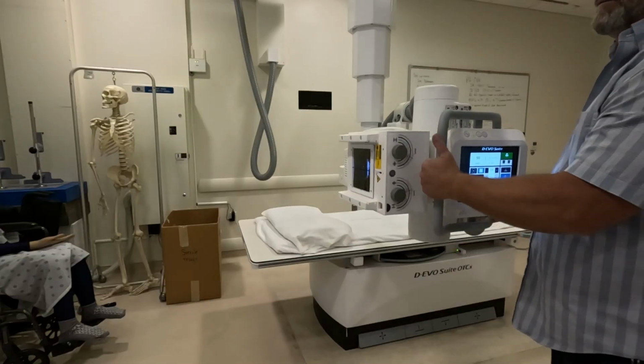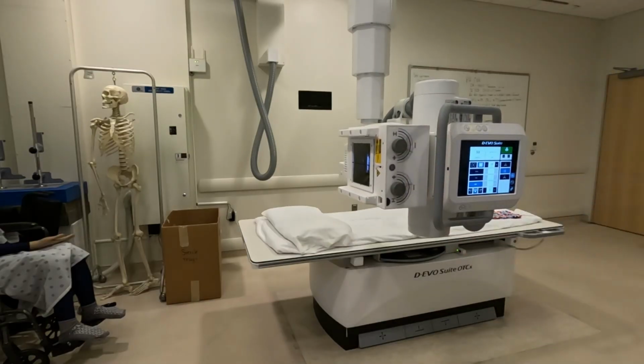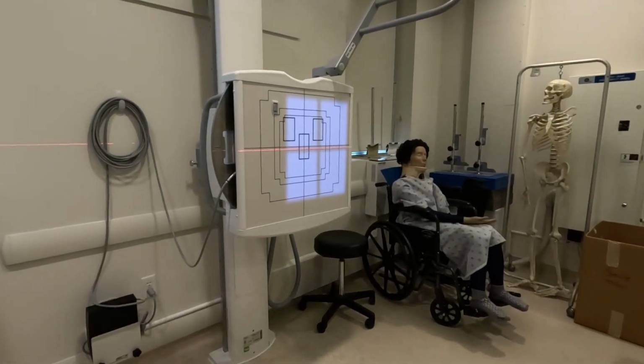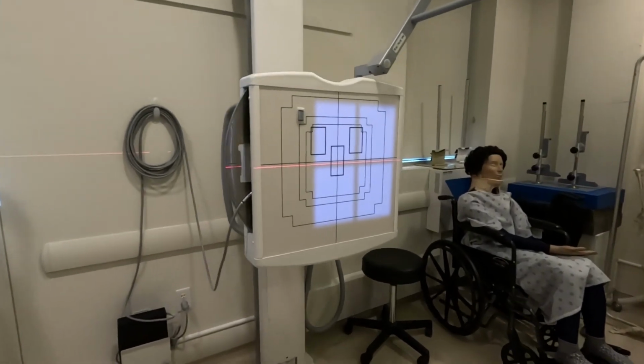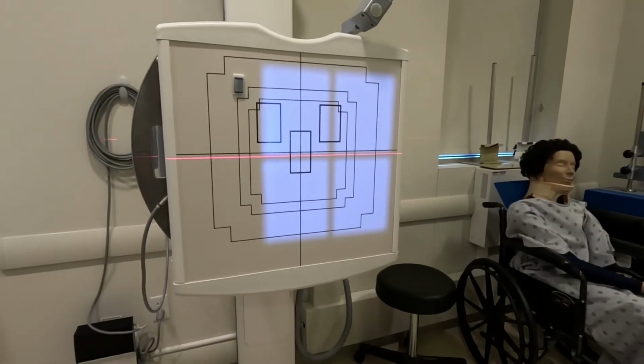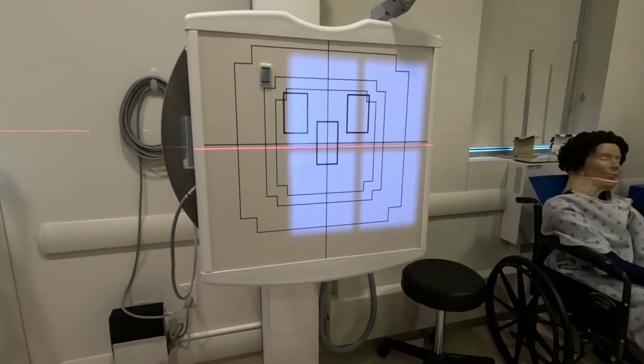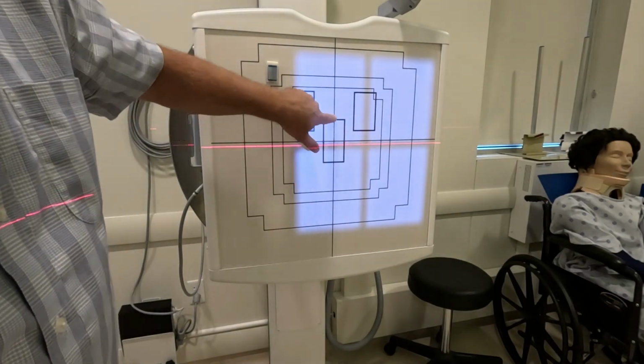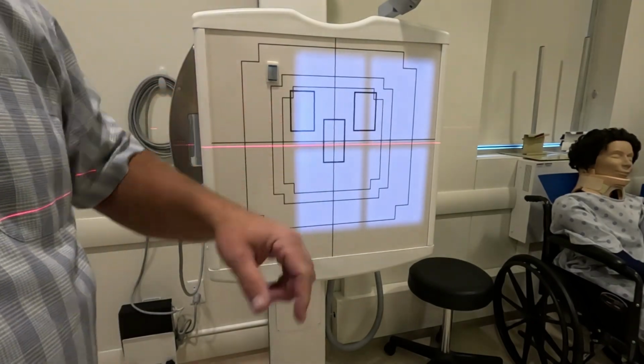Now, we've got one other thing. We have our distance right, but I want you to notice though that we've still got an issue, and that is that our tube is not aligned to our bucky. So these crosshairs need to correspond to these crosshairs. So I still have something to do.